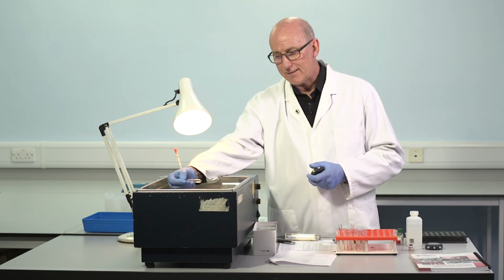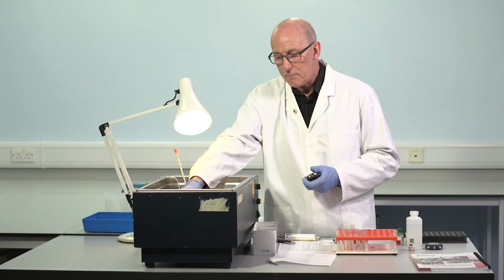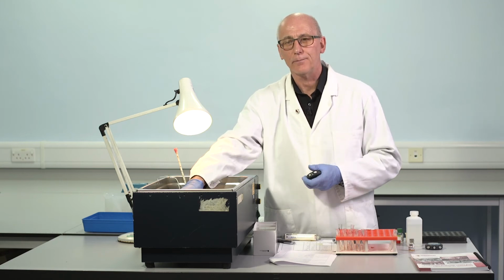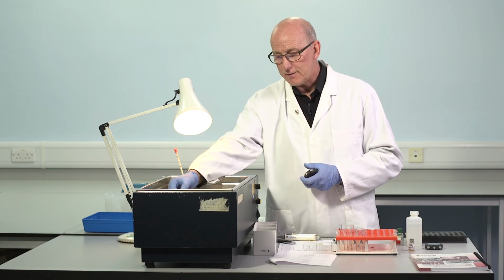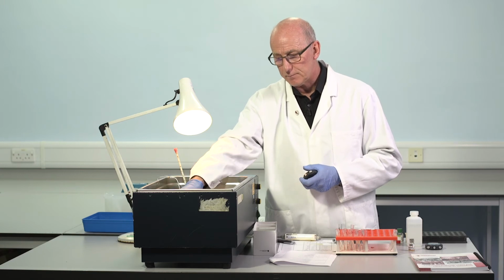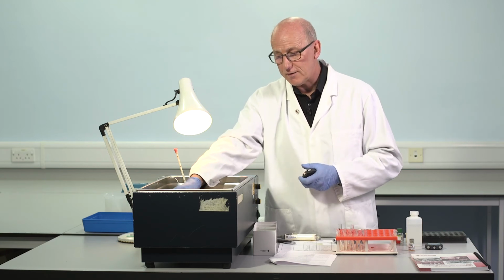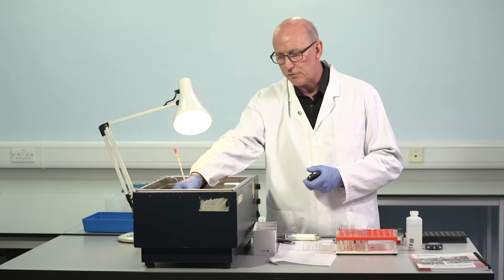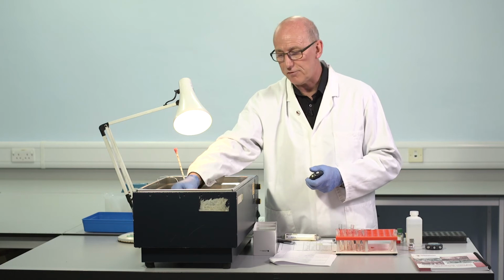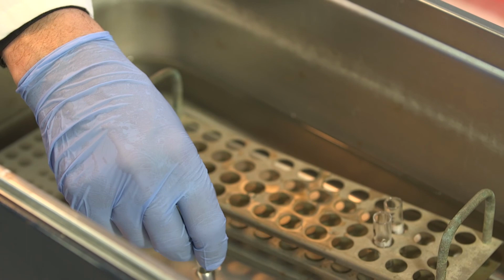And those of you who are running factor VIII assays on commercial large autoanalyzers, I imagine many of you will use additional concentrations, additional dilutions to construct the standard curve. And sometimes it's necessary to produce different calibration curves to deal with samples with particularly low levels, for example. On other systems, it is possible to use a single curve that's suitable for all the expected levels. So we have some discussion about that in the WFH laboratory manual. We have a section in there related to automation. And again, I have some comments on that in the section on factor VIII assays, and I would refer you to that.